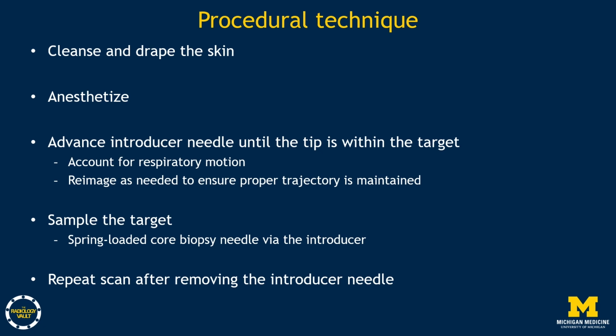Note that the pleural surface is very sensitive just like the skin, and adequate anesthesia is needed at this location to minimize discomfort and motion. Once anesthetized, patients will feel a normal pressure sensation during needle manipulation. Be sure to inform patients of what to expect prior to the procedure so they can anticipate these sensations. Moderate sedation is not necessary but can be considered in patients with severe anxiety. However, as previously mentioned, deeper levels of sedation, including general anesthesia, are best avoided.